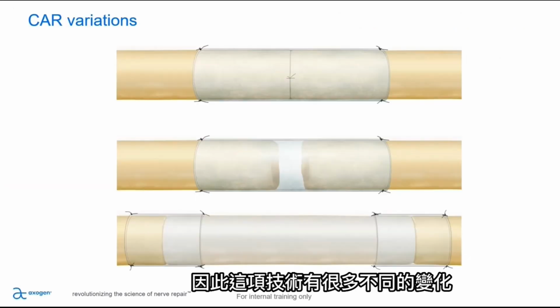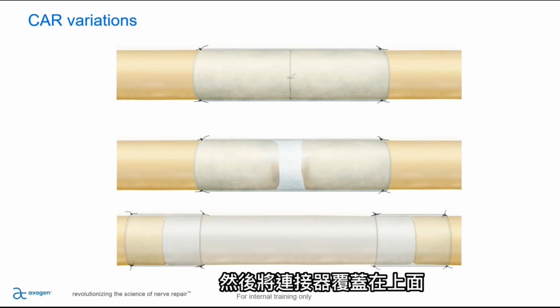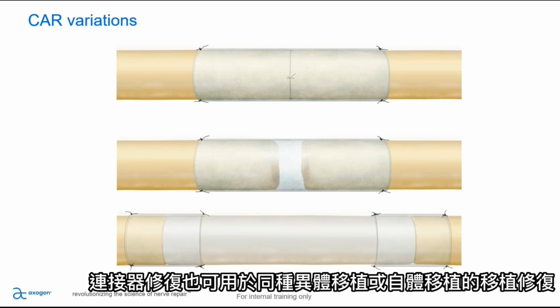And so there are lots of different variations to this technique. Some surgeons like to put a loose air knot to hold the ends together and then slide the connector over. Some like to leave a small gap between the nerve ends. And connector-assisted repair can also be utilized in graft repairs, either allograft or autograft.